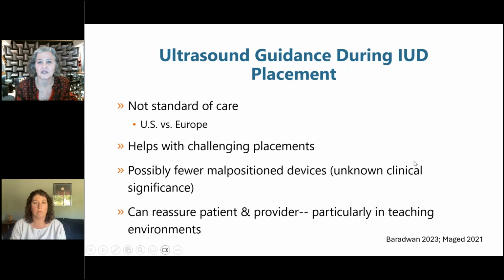So we did mention ultrasound a little bit. I do want to say that in the US, it is not standard of care, and many sites don't have an ultrasound at all. So if you don't have an ultrasound in your office, please do not feel like you're providing subpar care because you don't have that available to you when you have an IUD that you're going to be placing.